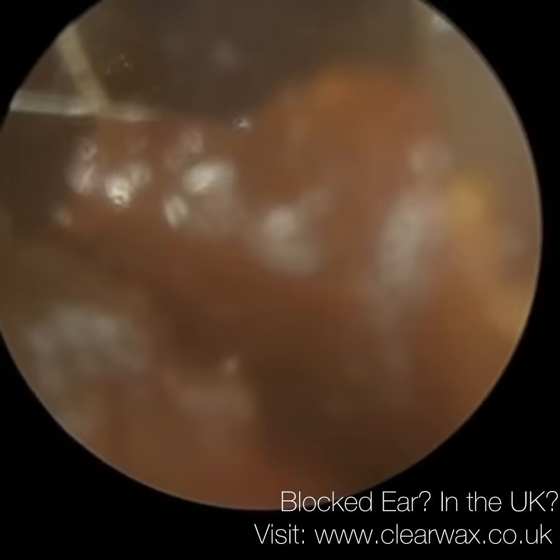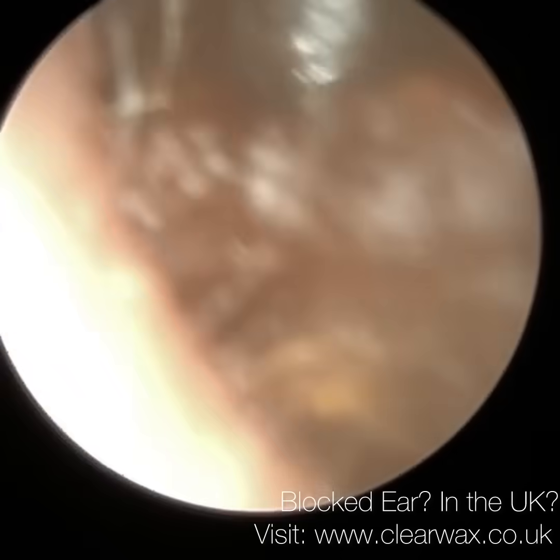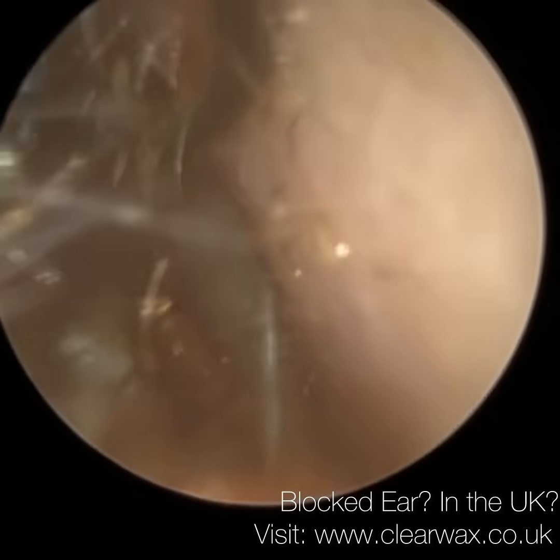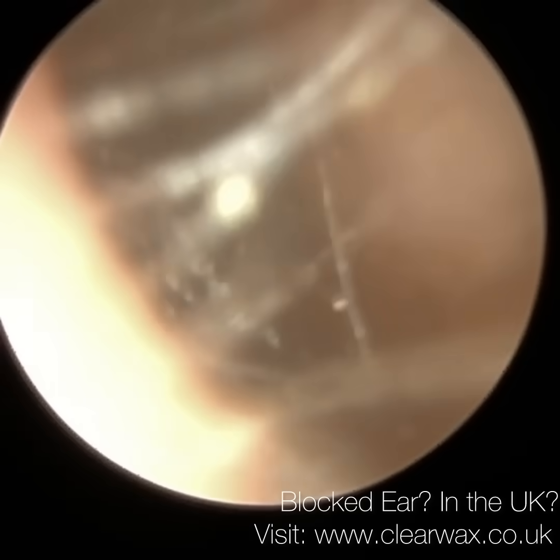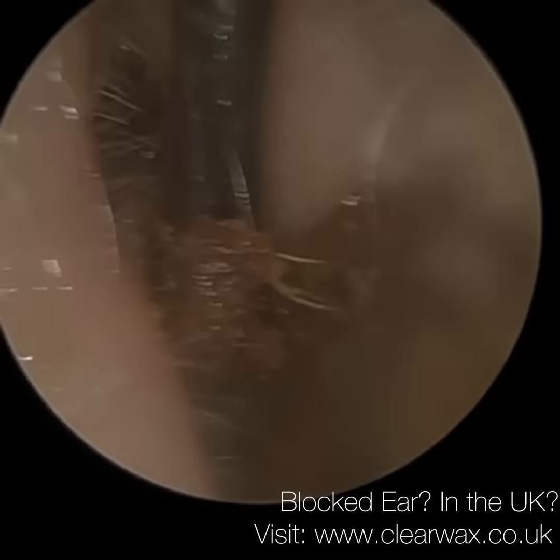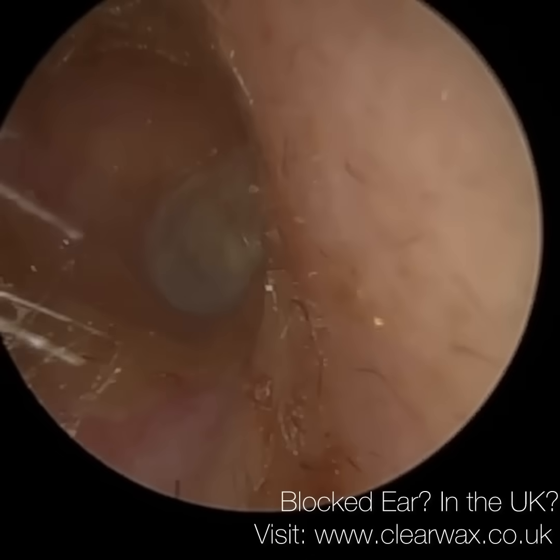So I'm just reaching deeper and deeper into the ear with the Curette. This is the right Curette. I'm just leveraging it out. I've got a little bit left, so this is half hanging out of the ear now. But I want to go in and behind. And then as I'm bringing the Curette out, I'm navigating the curvature of the ear, so I'm bringing the Curette from left to right as I'm coming out. And that's the big blob.